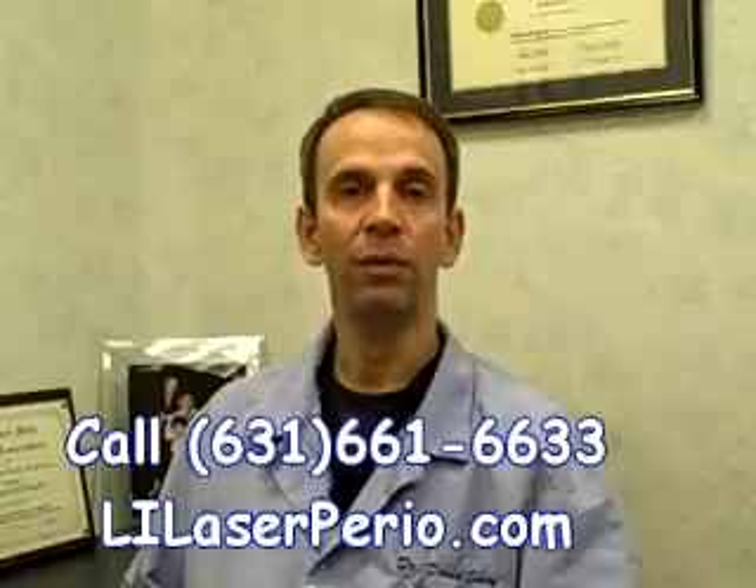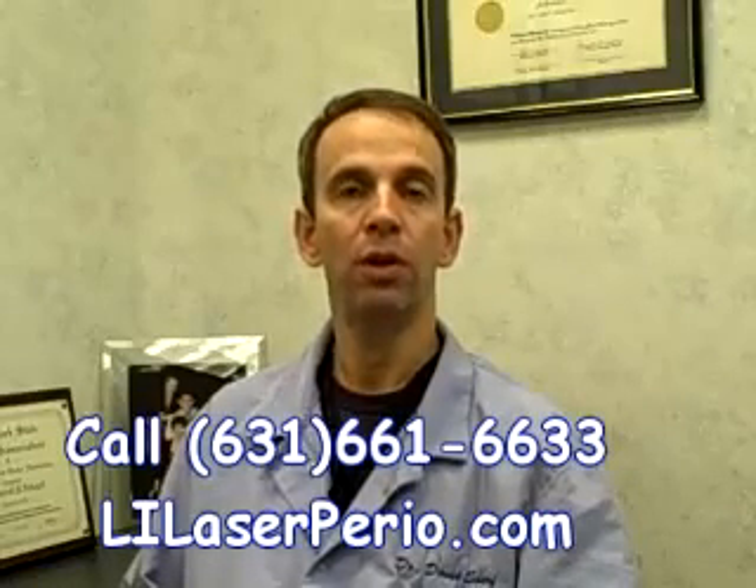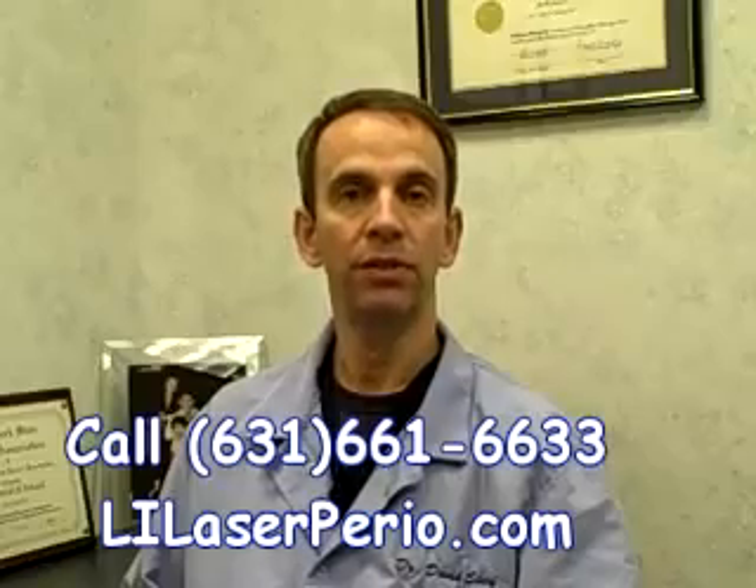Hi, I'm Dr. David Scharf, and the following is an animation of the laser-assisted new attachment procedure, which is a procedure for treating periodontal disease without conventional periodontal surgery.